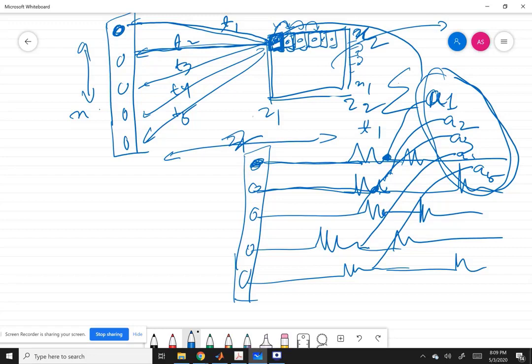Now reconstructing this image of course means that you have to go through the RF signals for each transducer, find the amplitude locations for each, and then add them up and then fix that amplitude value there. So depending on what is the granularity, like what is the difference between each pixel and what is the distance or what is the overall zone you want to construct, the time required for reconstructing each image will be more or less. So if you want to reconstruct images faster, then you should choose a smaller distance and you should have farther distances between the pixel values, pixel locations.